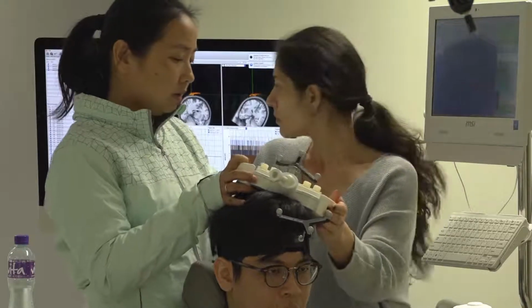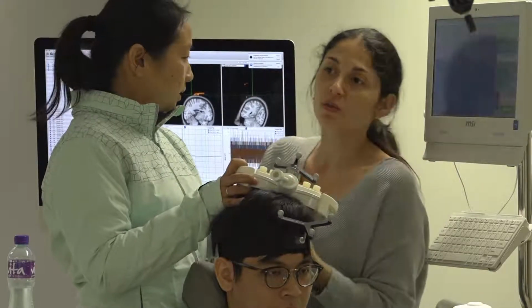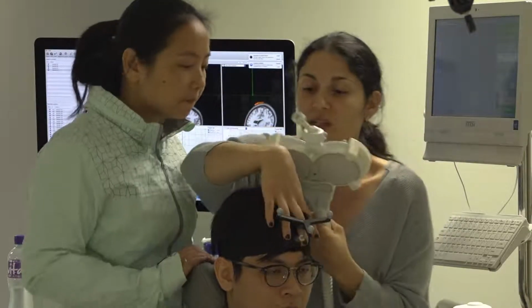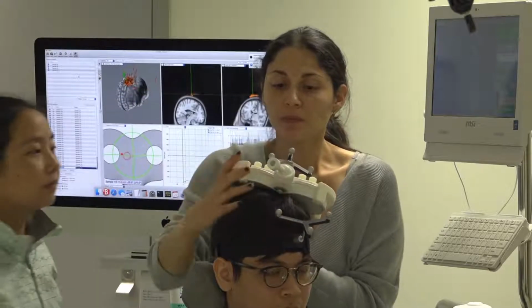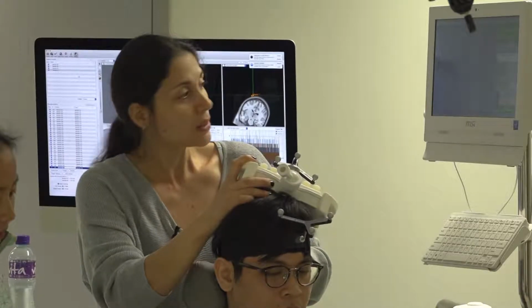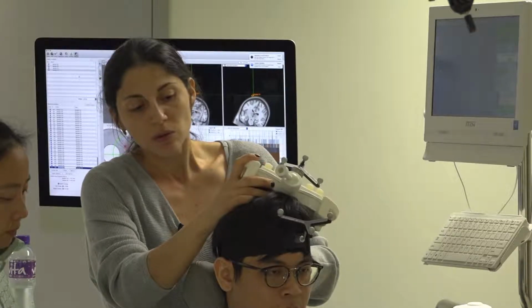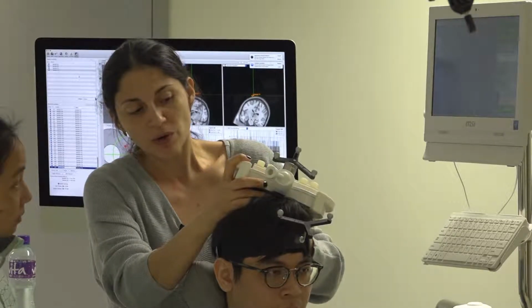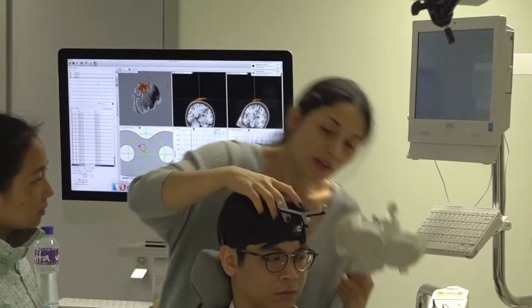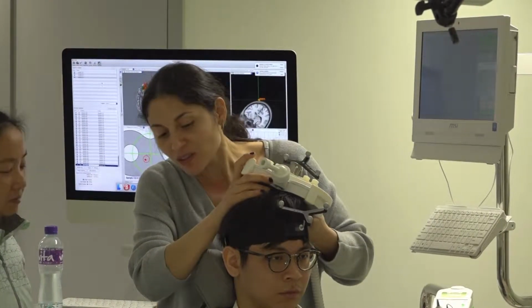So the idea is, if you don't have the spot, you need to try to find the spot, right? You can start locating in this way as I did before, something like this, and then from there start to play with this, looking around. You can really try. He's very unstable, like you get it sometimes and then you don't get it.